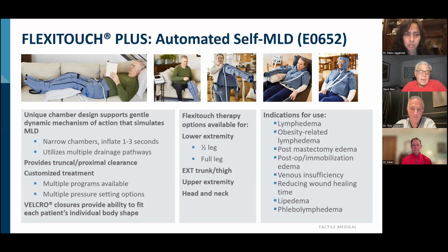And it does provide drainage from truncal clearance first, if necessary, meaning emptying the reservoir above, and then begins distal. Steve is going to talk about when you might use this device versus the basic device, especially in patients who have significant truncal edema aside from lower extremity edema.